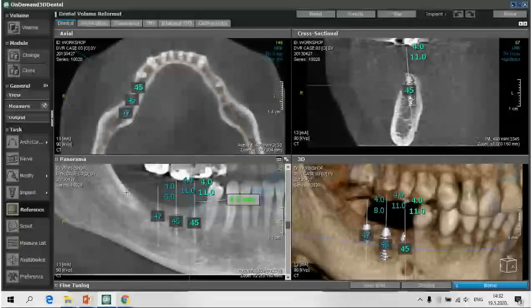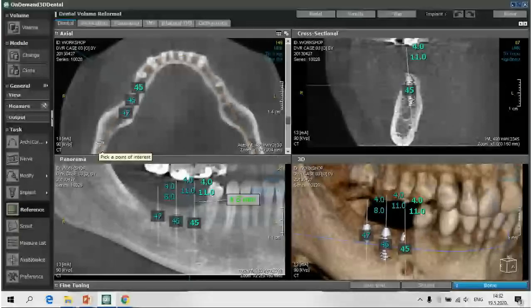But as best as we can in this moment, I will try to show you the procedure, how we do it, and later show some important notes after we do that procedure.